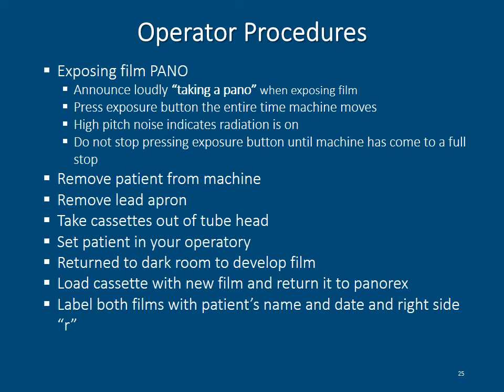With digital panos, you don't have to worry about these procedures because they're all automatically done, and you literally print out the image on paper, and you can let that go home with the patient, or the image can be sent digitally through email to their dentist.